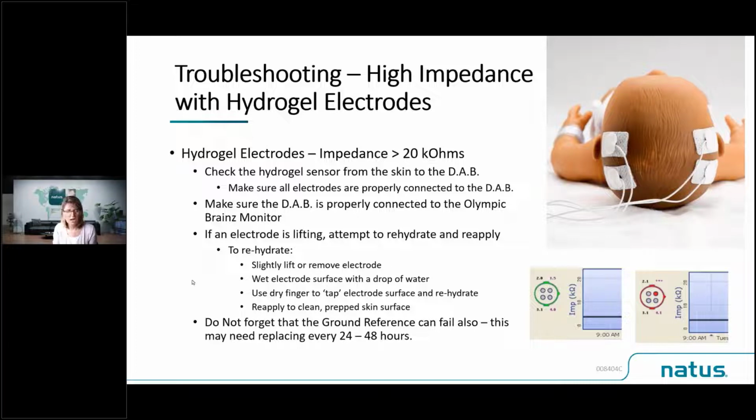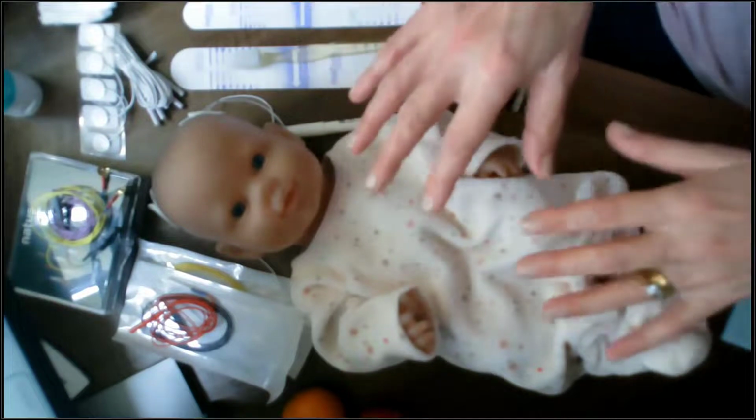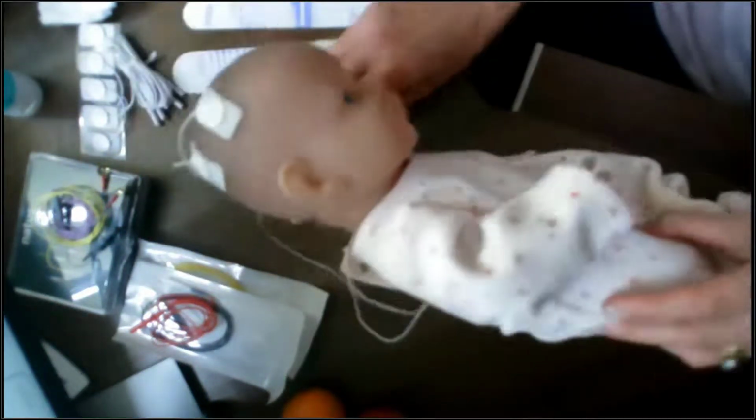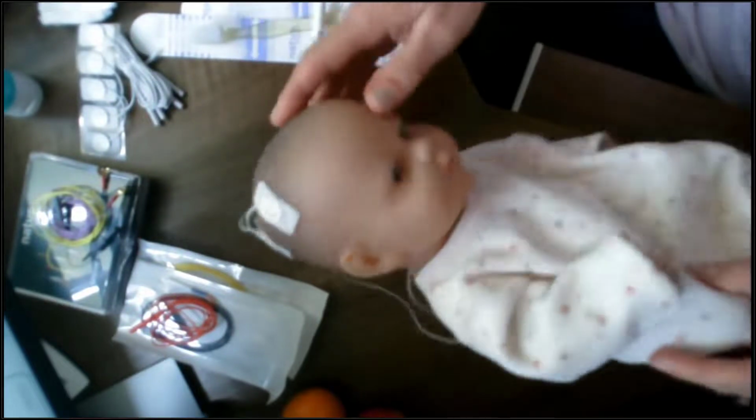Okay, so what I'm going to do is try to change my webcam, and try to do something very practical on the desk with you guys. So I'm going to stop the actual slideshow screen share so that hopefully you should see the desk camera in a bigger view. So here you have my baby. She's actually wearing hydrogel electrodes at this point in time.